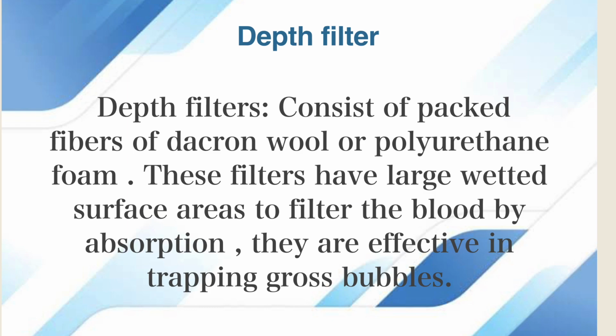Depth filters. Depth filters consist of packed fibers of Dacron wool or polyurethane foam. These filters have large wetted surface areas to filter the blood by absorption. They are effective in trapping gross bubbles.